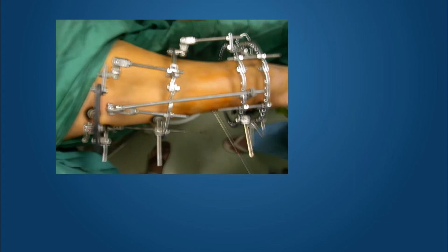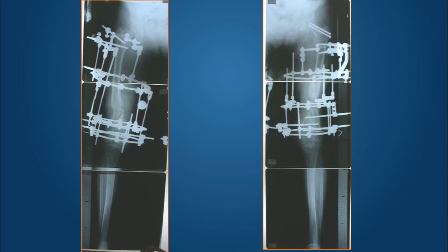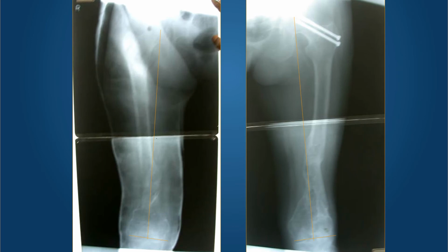And the same is the view from the top, which shows towards the left the anterior hinge, which is very proximal. The posterior hinge is below over here. This is the medial distraction rod, and the inclination of this wire shows the direction in which we are going. The same was done exactly as per plan on both the right and the left femora, and it shows us a very accurate correction of the femurs during the treatment in the AP view, showing a perfect 87 degrees of mechanical lateral distal femoral angle, like so, also visible in the result.